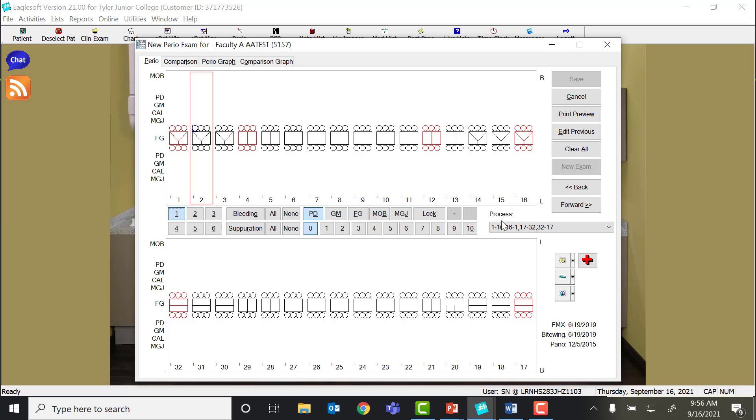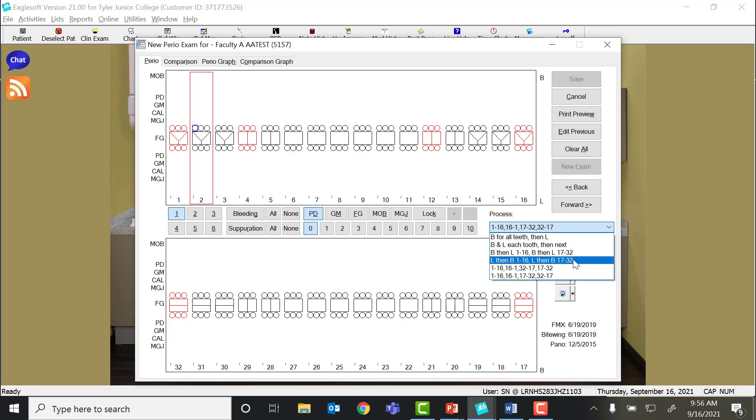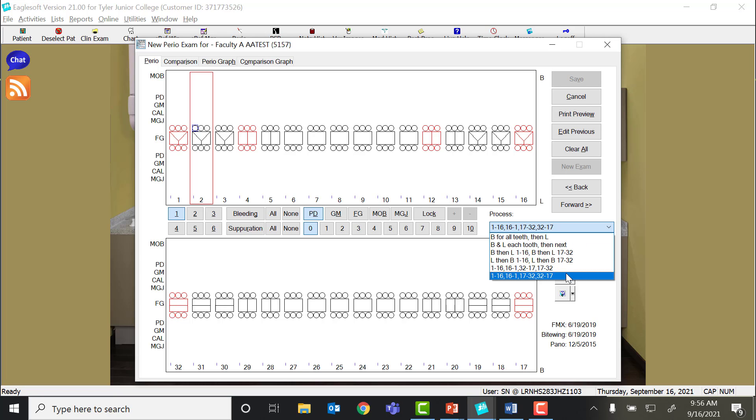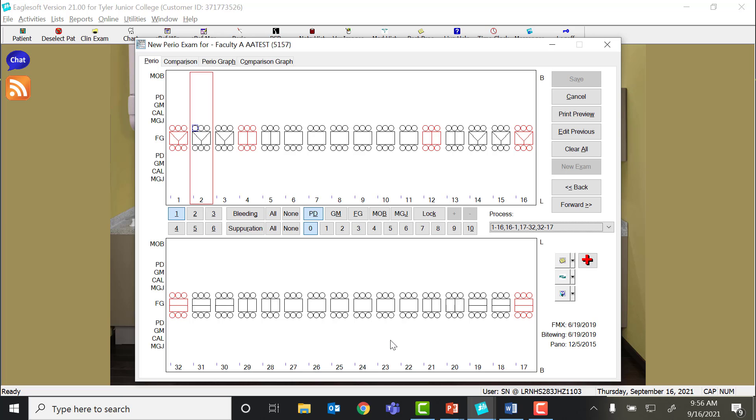Also notice the process here. This is the sequence in which you're going to probe. It does have a drop down menu that offers you a few more options, but this is the most common. We do not let you customize Eaglesoft to go in any other sequence other than what is already preselected.